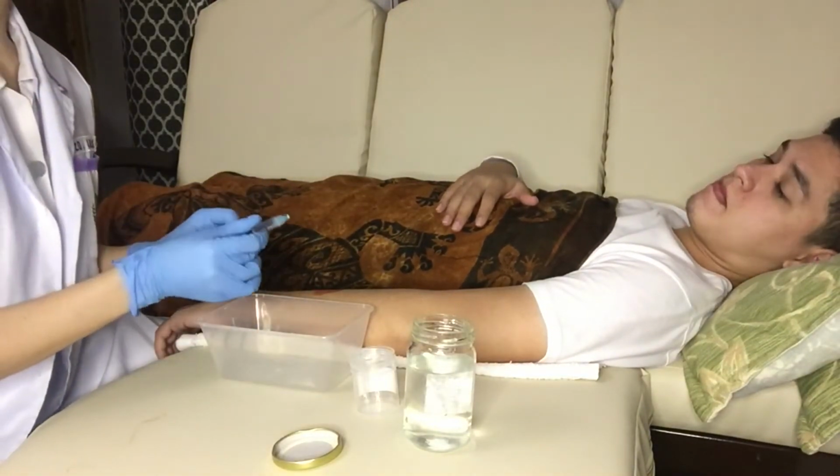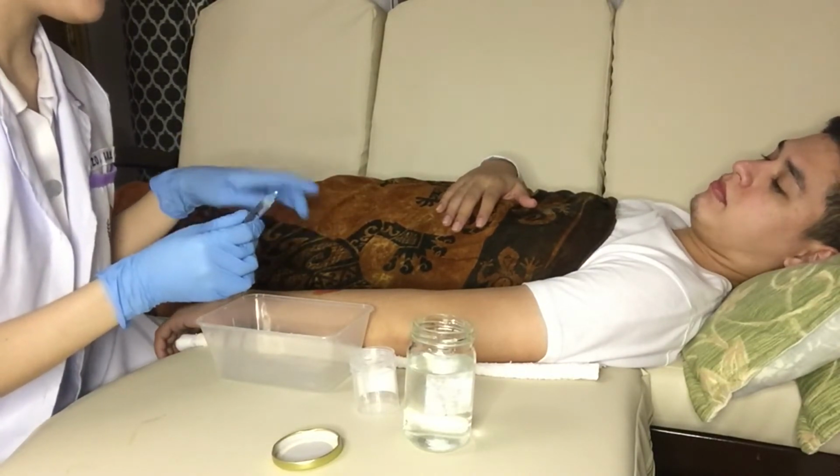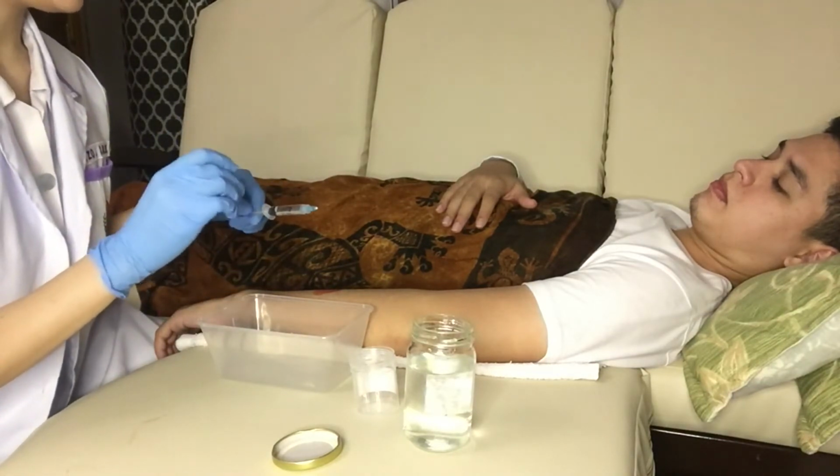Sir, mag-irrigate ko karon sa imong wound ha para malimpyuhan imong mga nana-nana, tapos pasilitan nako siya og normal saline solution. Okay.